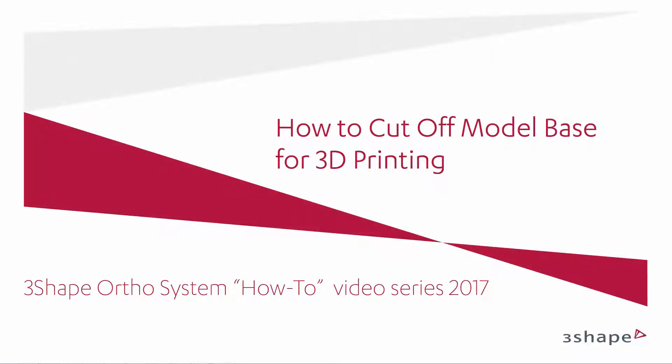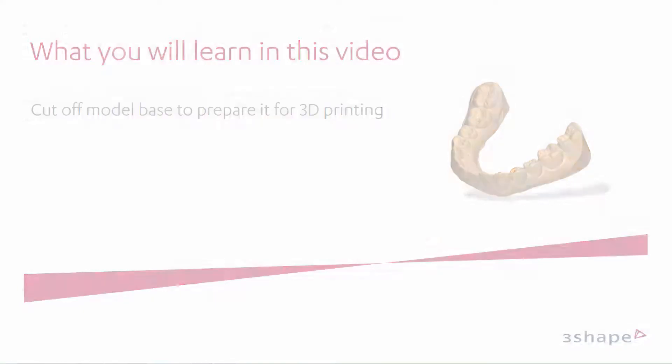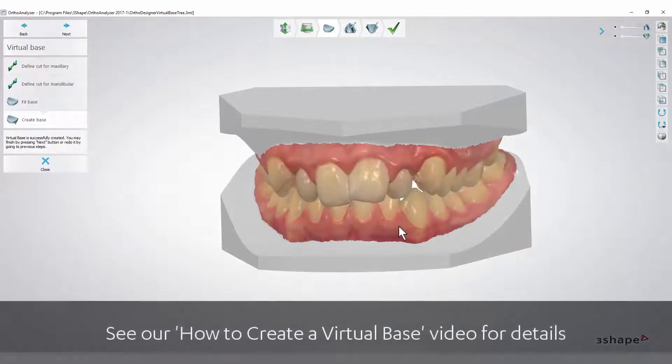In this video we will show you how to cut off the model base for 3D printing. You will learn how to use the OrthoAnalyser tools to cut off the model base to prepare it for 3D printing. When you have finished making a virtual base, you will wish to print it and make an arch model.